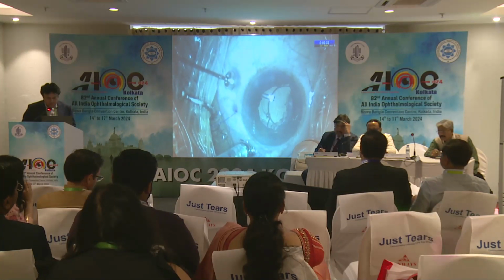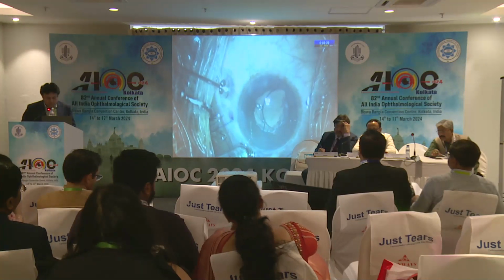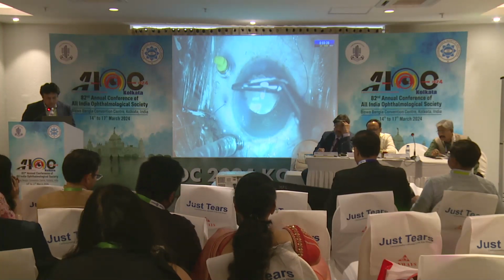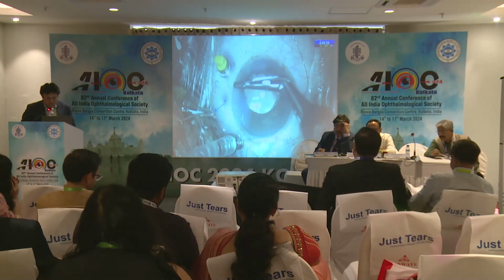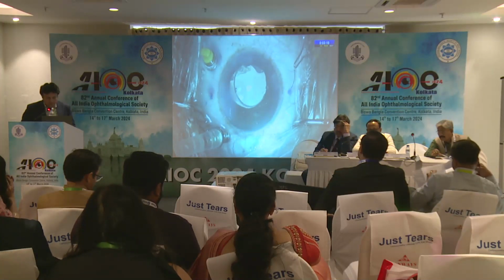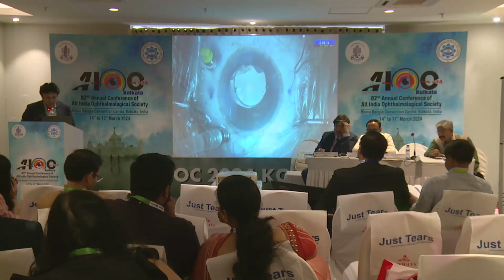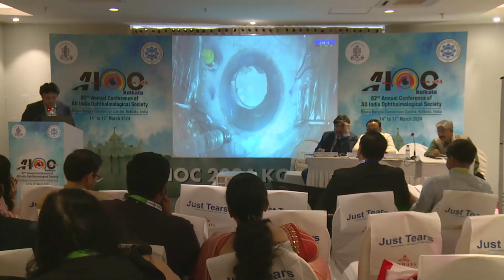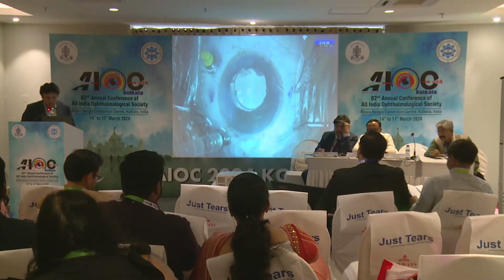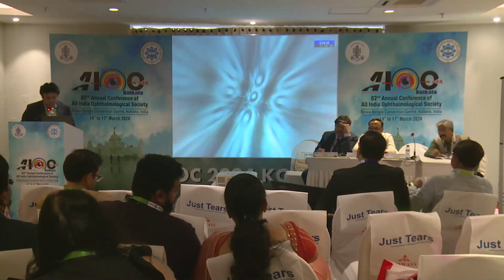Now a pars plana vitrectomy and a posterior capsule cleaning is also done. A cautery is then used to form a nice bulbous flange on the 6-0 Prolene that is outside the anterior chamber. The same step is carried out on the other end. Now the flanges are buried to lie intrasclerally, thereby achieving a well-centered intraocular lens.